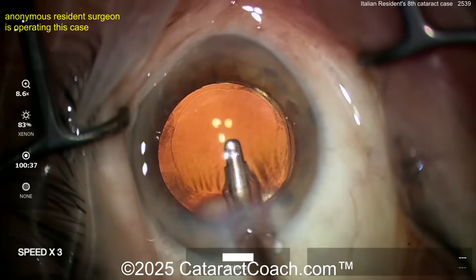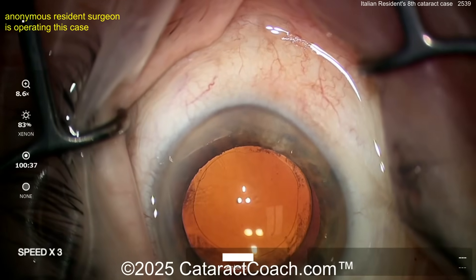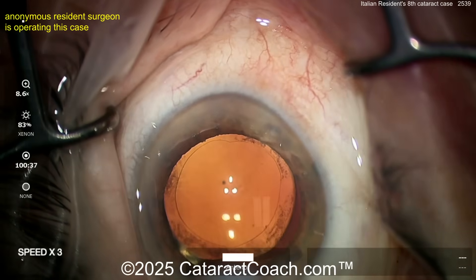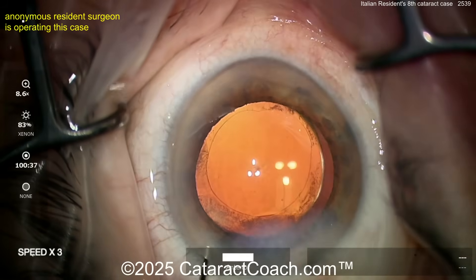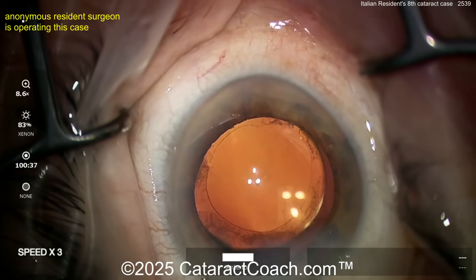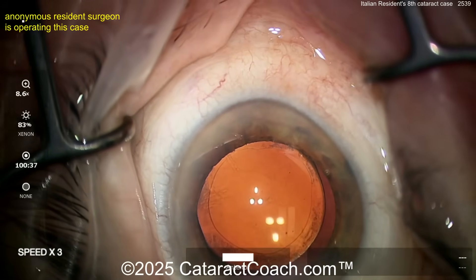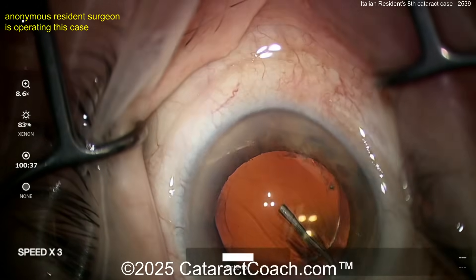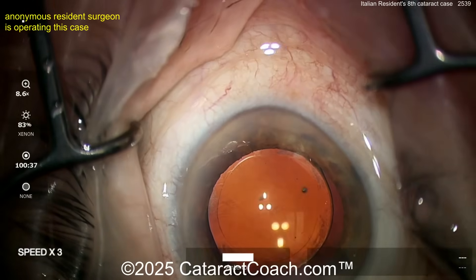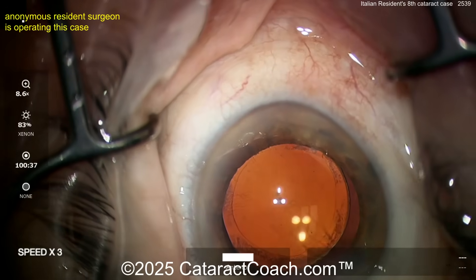Finishing up at the end. I want to see how you hydrate the incision — let me see if you really watch Cataract Coach. The sidewalls — okay. It's a little bit more hydration than I like, but you're learning. Maybe watch some of my videos. If you go to CataractCoach.com and click on the complete list of articles and videos, look for the ones called Complete Cataract Cases — it's only me operating. That's how you see how I operate. Complete Cataract Cases on CataractCoach.com.